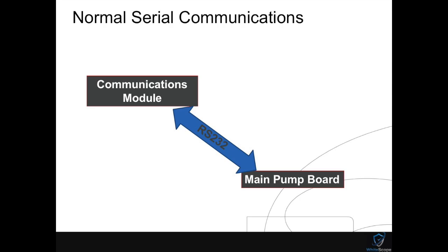mangled in transit. One of the things that we talked to the manufacturer about is the separation is really good, right? That's exactly what you want when you design a pump like this or anything that's really sensitive. You usually want separation between your communications module and your main pump board. One of the things we're really concerned with is that the communications module actually offers the pathway to do firmware updates, right? That's a by-design bridge to get from the communications module to the main pump board itself.